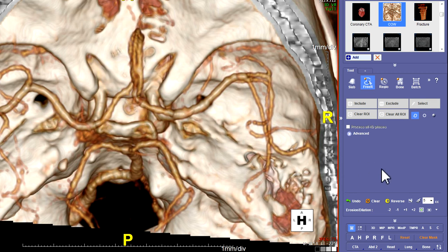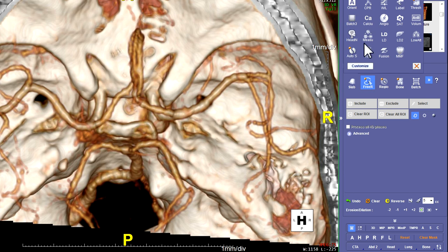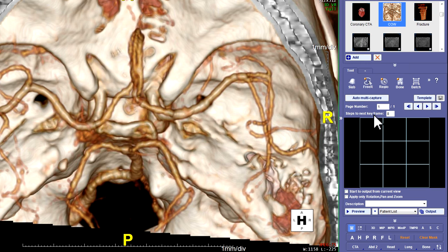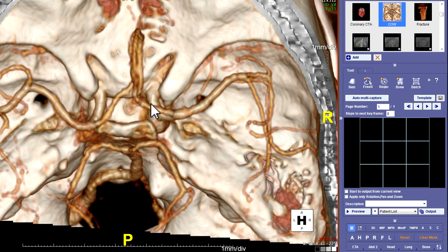Now we're going to make a 3D batch. You might have a 3D batch here, or you may need to click the two little arrows to open up the supplemental menu. Then it says Batch 3D Tool — that's what you want. It looks like a little movie film. Click that and you get this little panel. Be sure it's set on eight steps to the next frame — that puts a lot of nice pictures in between captures to get a good movie. To capture, you can right-click, hit the camera button, or just hit C. Right-click for the first one and say Capture — capture a straight head.